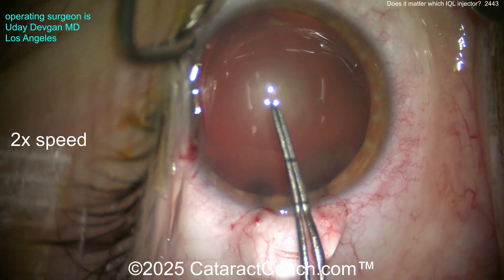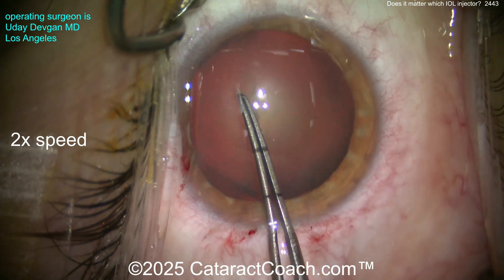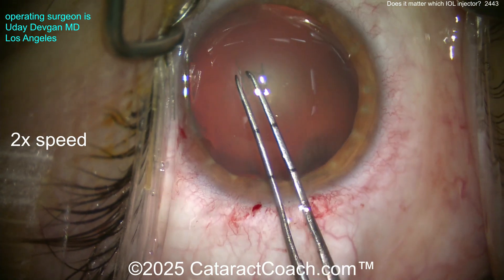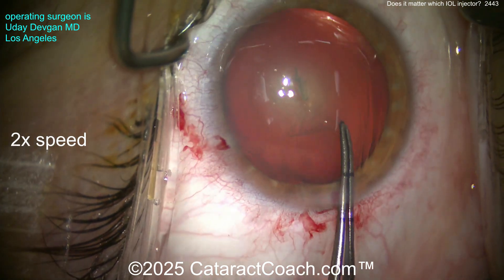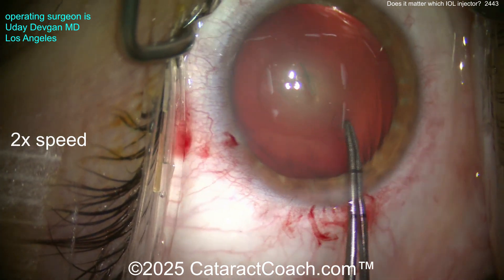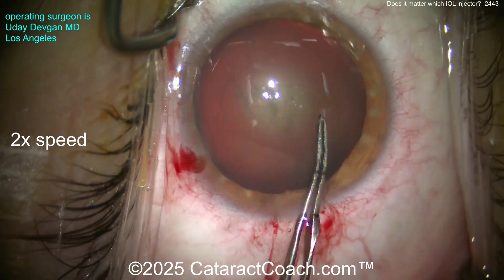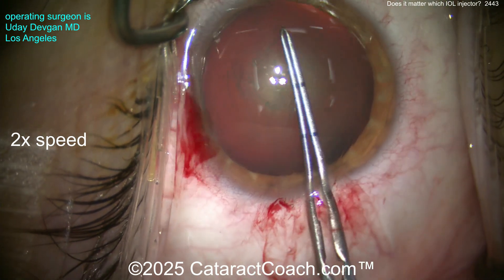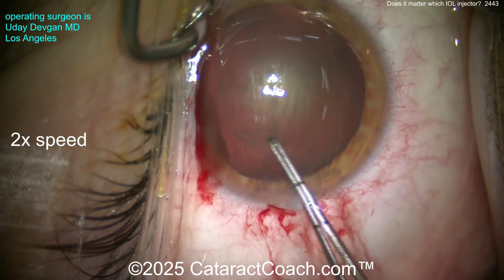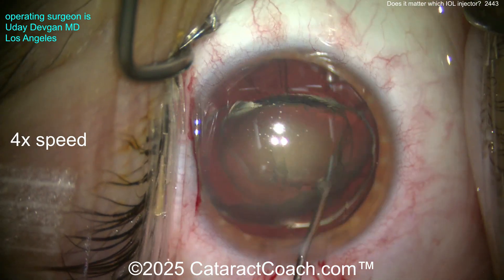This is a very highly myopic patient with a very large corneal white-to-white measurement. We're using forceps marked at two-and-a-half and five millimeters from the tip to judge the correct rhexis size. You can't just follow the pupil dilation — this is a 10-millimeter dilation but the white-to-white is about 13 millimeters — a very large eye. The optic is only 6 millimeters, so we definitely want an appropriate rhexis size.